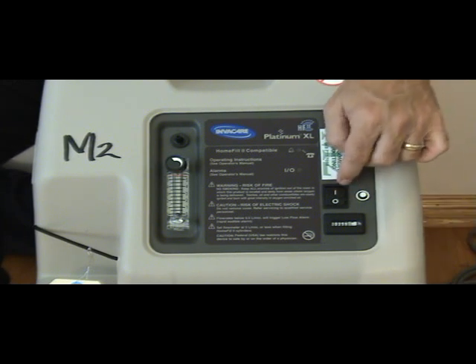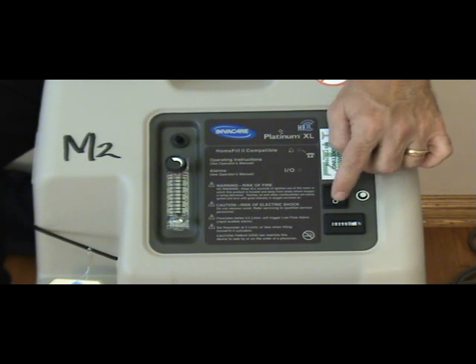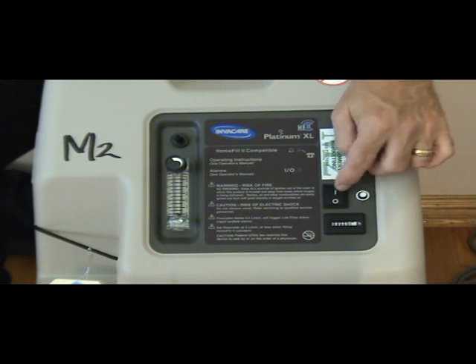This switch right here, this is the on-off switch. I'm going to turn this on in just a second. The on-off switch is a rocker arm, so it's very easy to work with. If you push where the I is, you push it down, that turns the unit on. If you push where the 0 is, that turns it off.